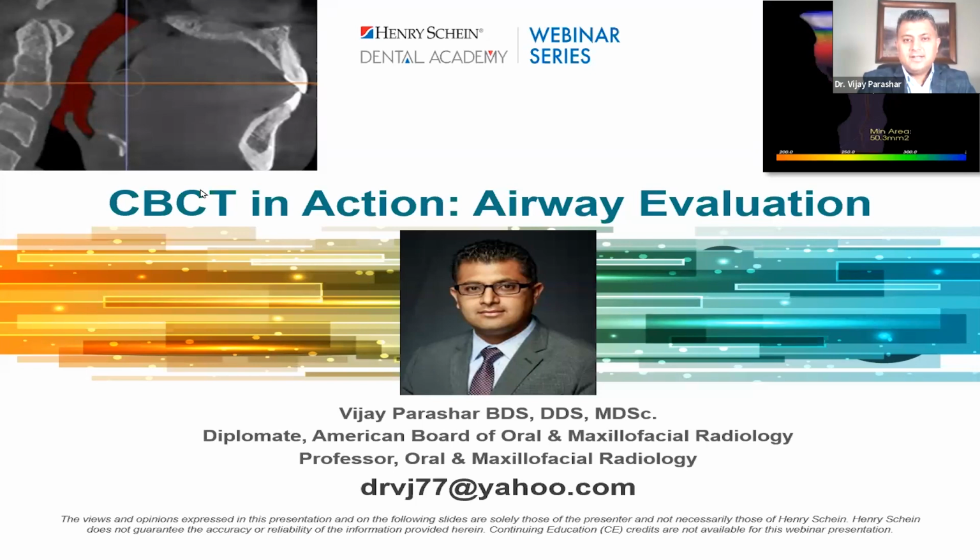Let's get started. So as Shirley said, the topic today is airway evaluation.